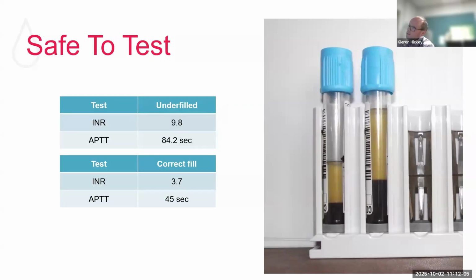And you can often see a similar pattern of results with high hematocrit samples. So vigilance, either through automated but visual inspection is just as good, depending on the analytical capacity you have in your institution to identify high hematocrit samples and samples which are underfilled. Next slide, please.